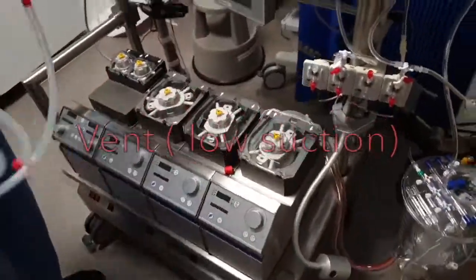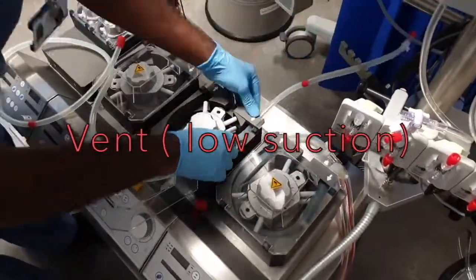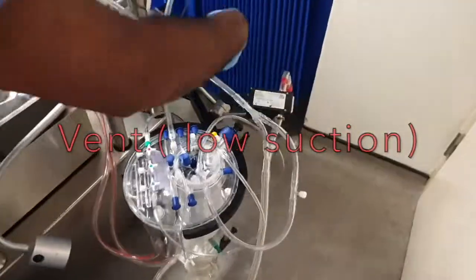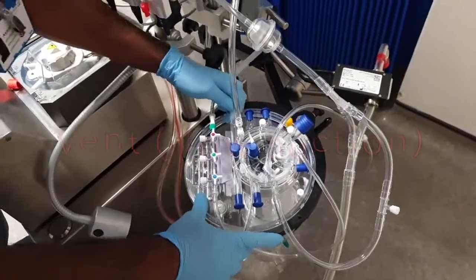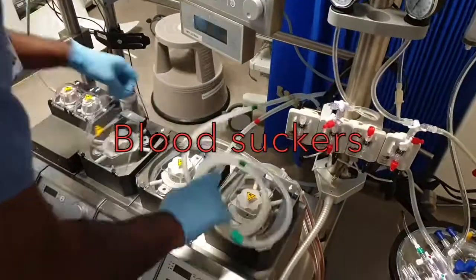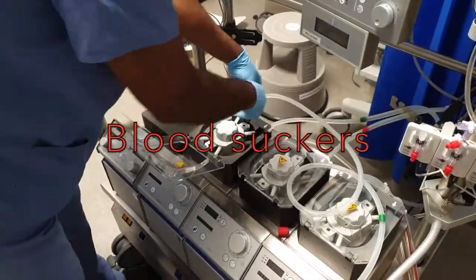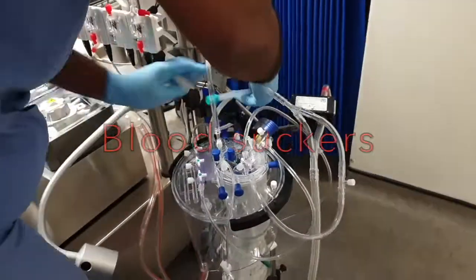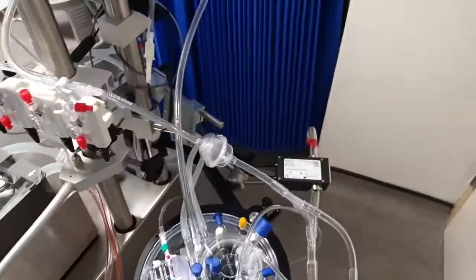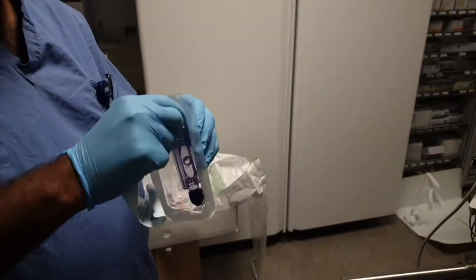There are various sections which recycle the blood. This is inline monitoring to measure various parameters in the blood.